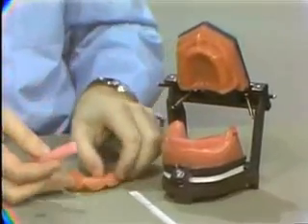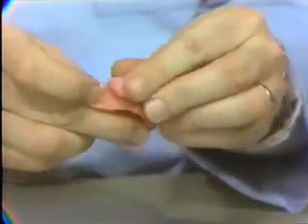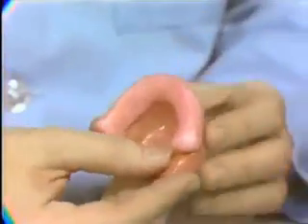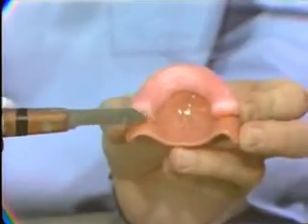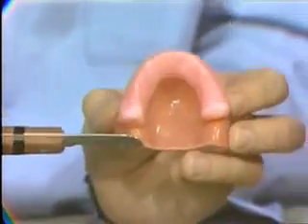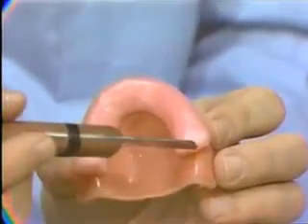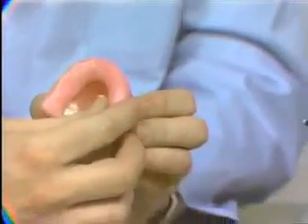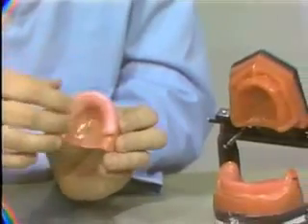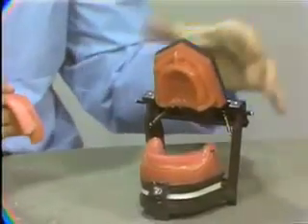Now, on this base plate that you have made, we will adapt a soft mass of wax. Now, I think worth pointing out to you here that you don't have to bring this roll all the way back to the end of the base plate. It's not necessary. A centimeter in is fine. Okay, now while that is still soft, you notice I put some sticky wax on to make adhesion a little more efficient. The next thing that we do while it's still soft, we go to the patient's mouth.